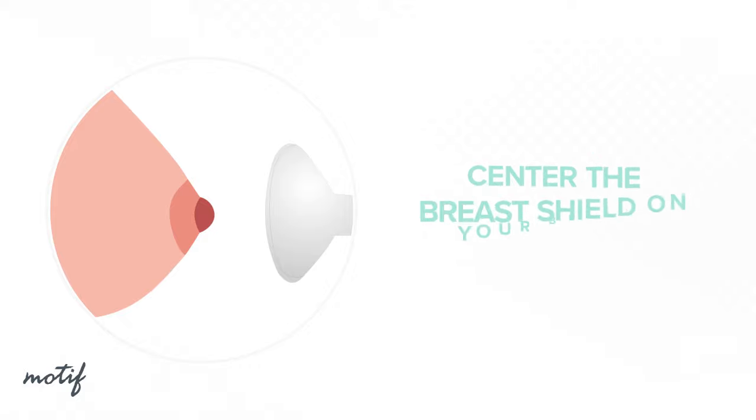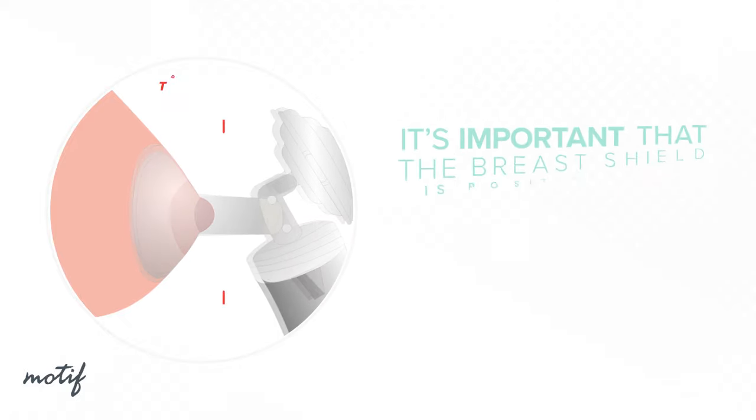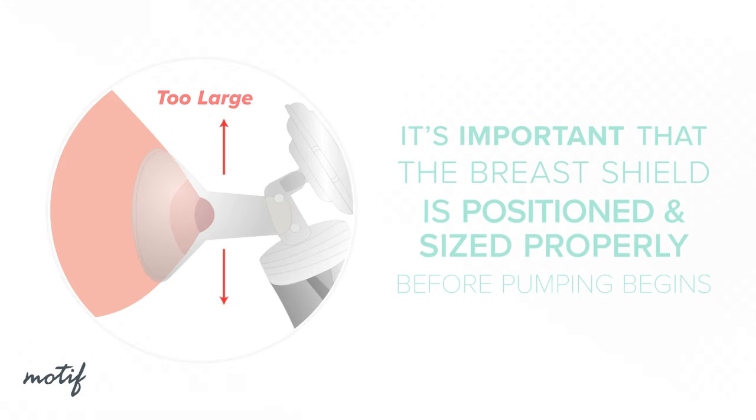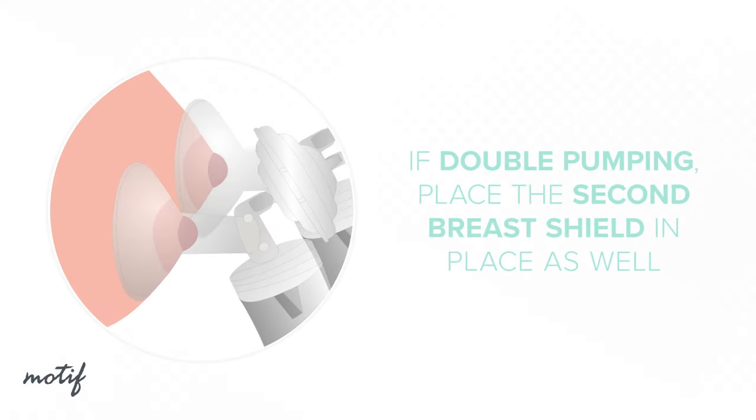Now that your Luna is assembled, center the breast shield on your breast so that the nipple is drawn into the flange. It's important that the breast shield is positioned properly before pumping begins to avoid any pain that may be caused by rubbing or twisting of your nipple onto the side of the flange. If double pumping, place the second breast shield in place as well.